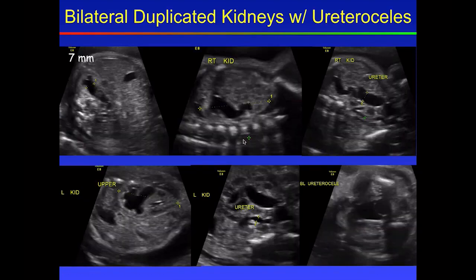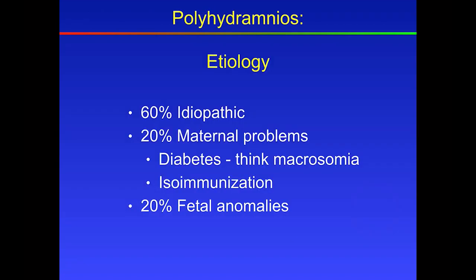In contrast to this patient that had dilation of 7, and when you looked longitudinal, you saw upper pole dilation with just a little bit of lower pole dilation, a very large dilated ureter. And when you looked at the other kidney, you saw upper pole dilation with lower pole looking good, a little bit smaller ureter. And then when you went down to look at the bladder, you could see the ureterocele right here, where there's a little balloon inside the bladder. We always say that the upper pole obstructs, and those are both vowels, U and O, and the lower pole refluxes, L and R, both consonants.